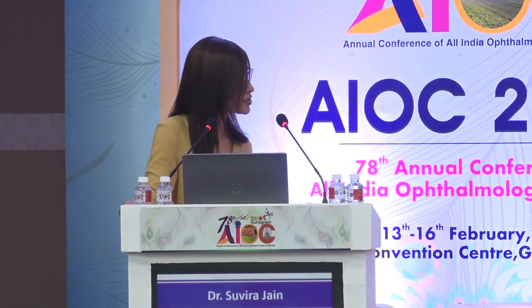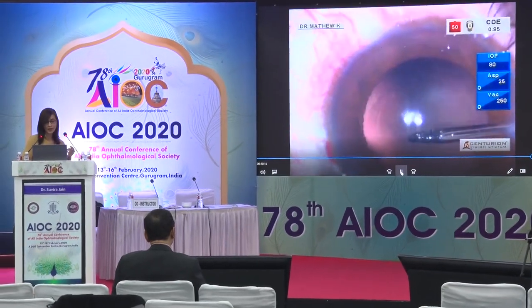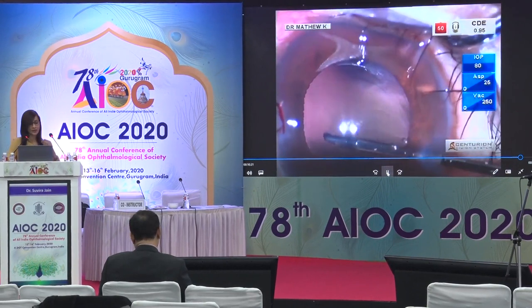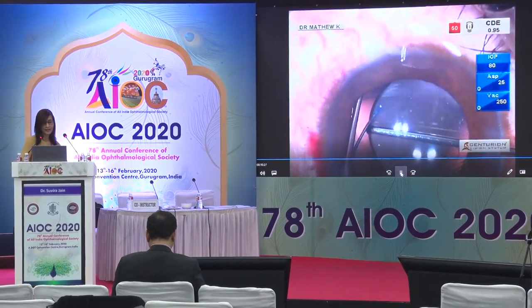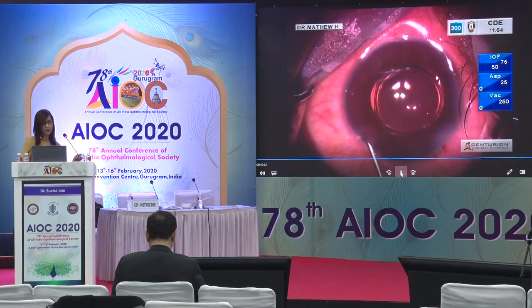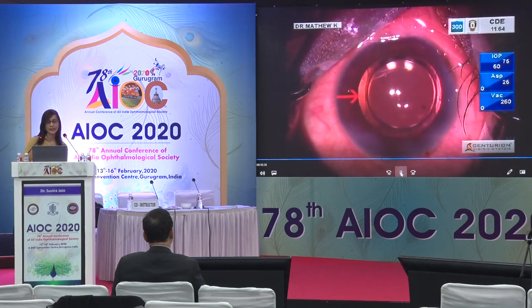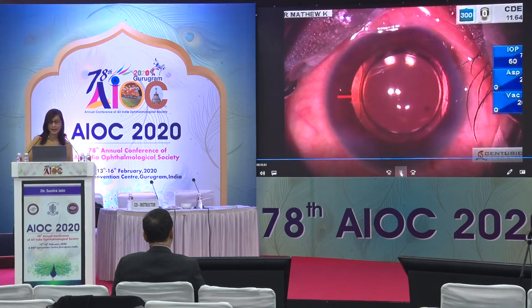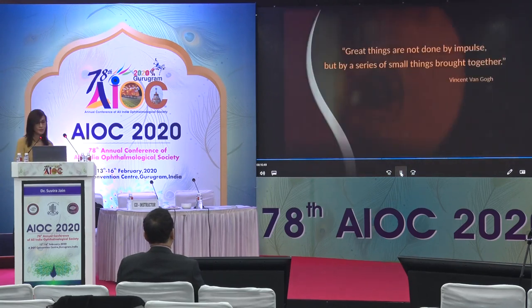You never do a capsule polish in patients with a polar cataract because there is still a propensity of a rent. In this case there has been a localized opening with the help of an intraocular forceps — it's converted to a round circular opening, after which the surgeon places a three-piece lens in the confines of the capsular bag. And finally — it's not over until it's over — even stromal hydration has the propensity in a polar cataract to result in disruption of the posterior capsule.